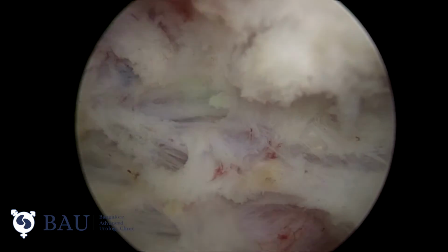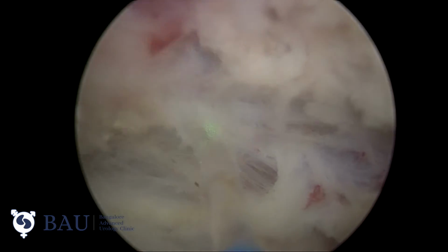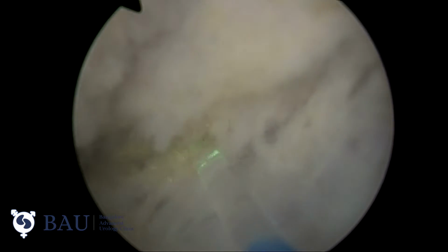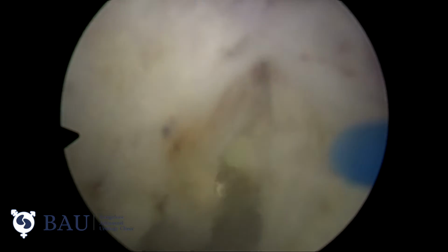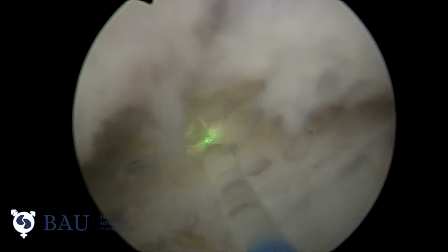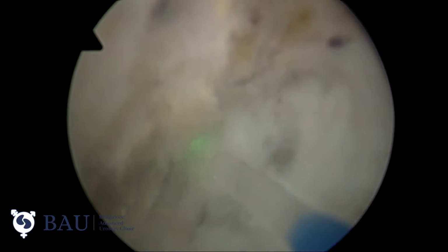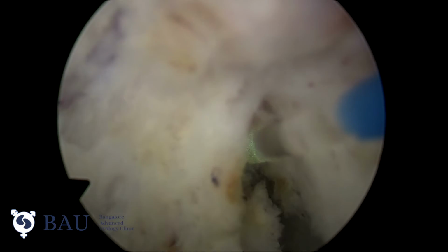Here the capsule is very thin, so we should be extremely careful while dissecting the capsule from the lobe. It is better to be towards the prostate gland rather than going towards the capsule. You can appreciate the capsule of the prostate, and as long as we are in the good plane, continue the dissection.